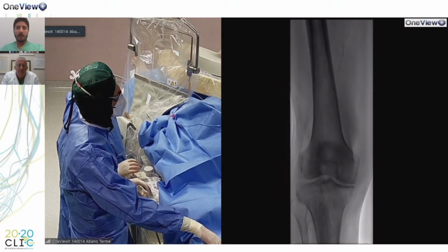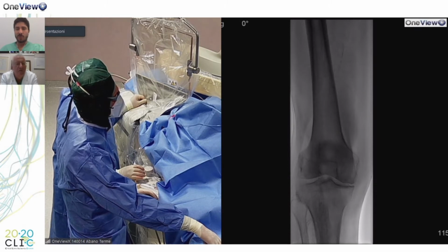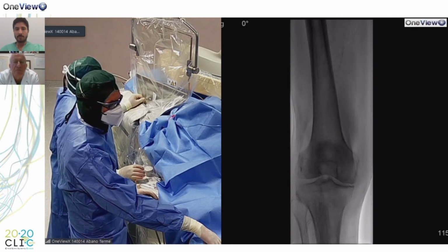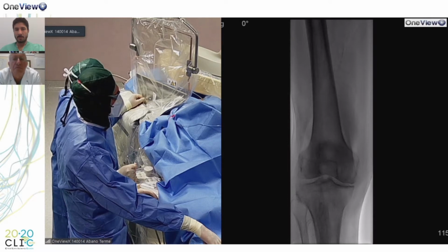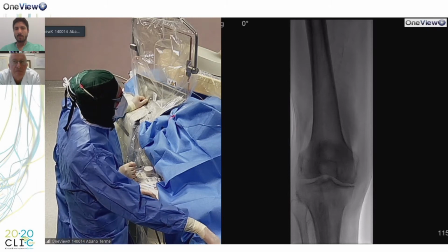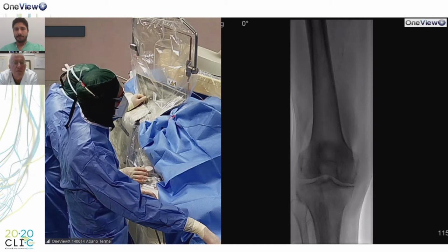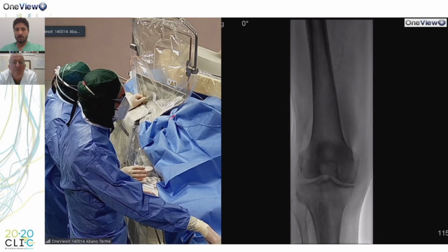Marco, can you tell us in the meantime the dose of CO2 you are injecting, the parameters? Yes, of course. We use a standard injection from the automated Angiodroid injector, and we are using now 20 ml of gas with the pressure 120 millimeters Hg. This normally is enough to visualize all the axes. Are we ready? Let's go.